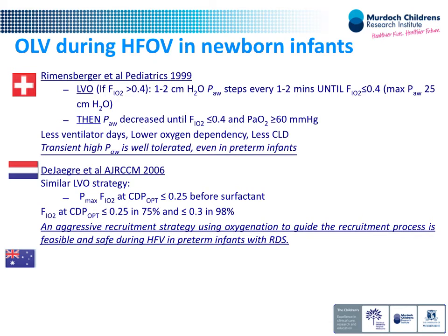So this is a different approach. But if you're a rescue treatment surfactant center, as most of us are, based on the evidence out there, then I think that I would like to avoid conventional or non-recruitable ventilation for even 10 or 15 minutes.